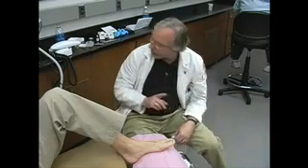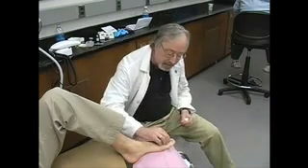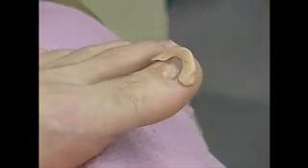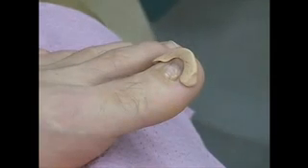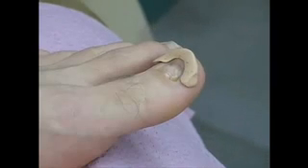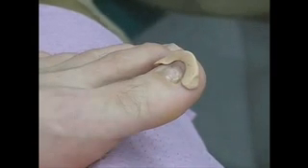But there is one part you want to be very careful of, and that's that you don't get it back on the posterior nail fold or on the sides of the lateral nail folds. So you're really just trying to work within that area, because if you go over it, it adheres to the skin, it can create problems. So be very careful that way. That's where your practice comes in, just trying to make sure you're staying within it.